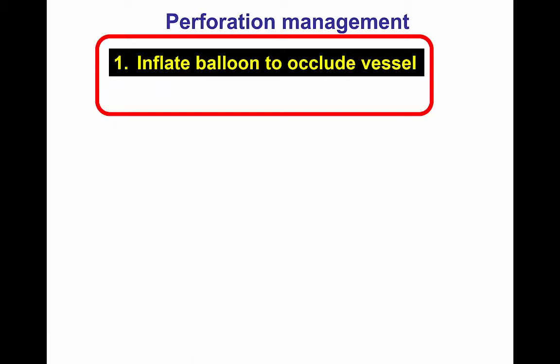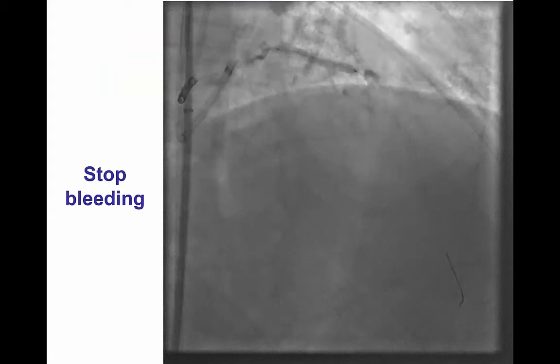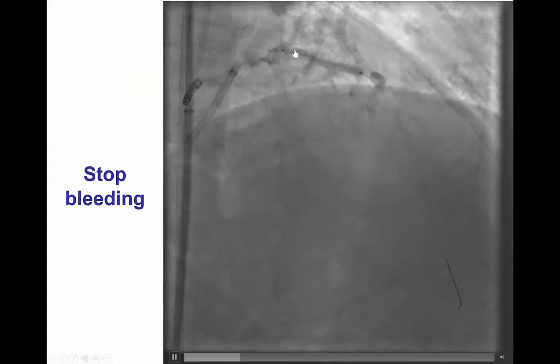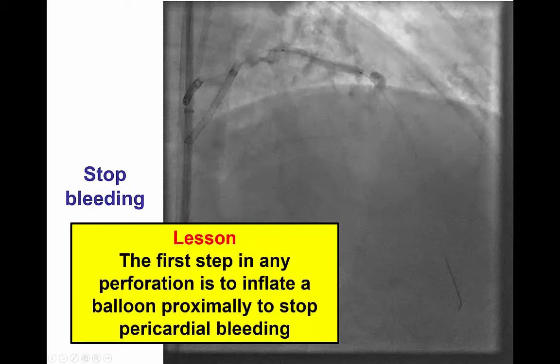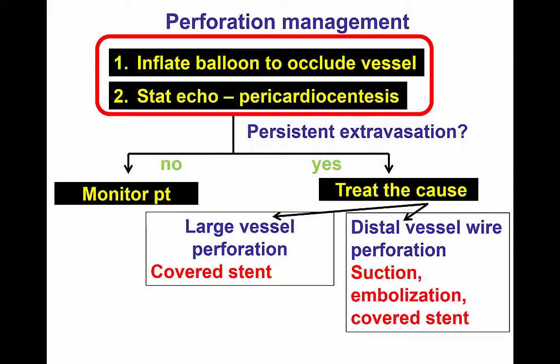Once the perforation is found, the very first step for any kind of perforation is to inflate a balloon so that the vessel is occluded and the risk of tamponade goes down. That's exactly what was done in this case. A balloon was advanced over the guide wire, inflated proximal to the perforation, and there is no ongoing extravasation in the pericardium. Standard approach for every perforation: balloon is inflated so that pericardial bleeding is stopped.